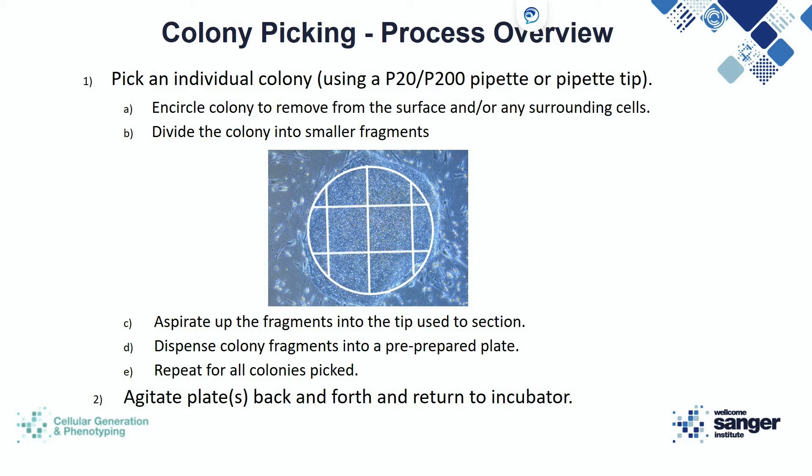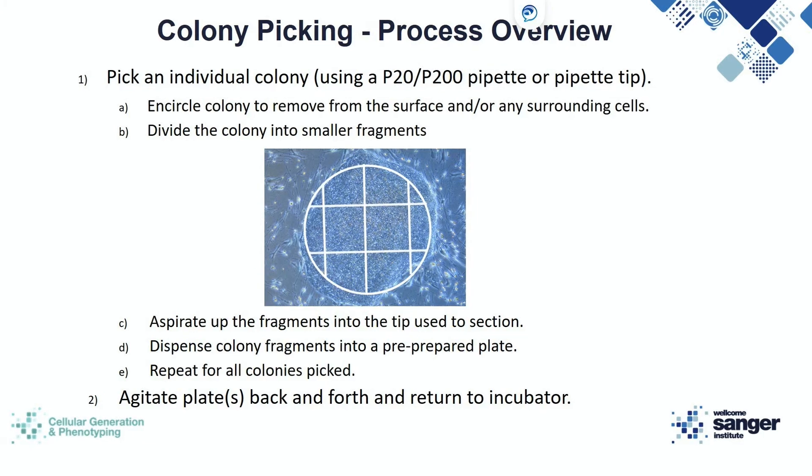With the first pass around, you do not need to be very accurate. Once you have isolated the colony, begin with linear strokes to break it down into small fragments, then continue with vertical or horizontal sectioning. Once you do this, the fragments may become loose and start floating — this is a good time to collect them with the pipette tip. Once you've collected all the fragments, transfer them straight into the pre-prepared plate.